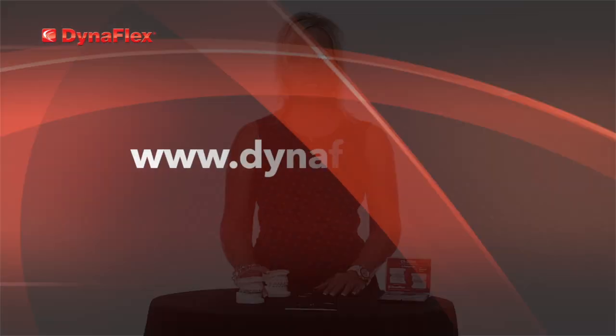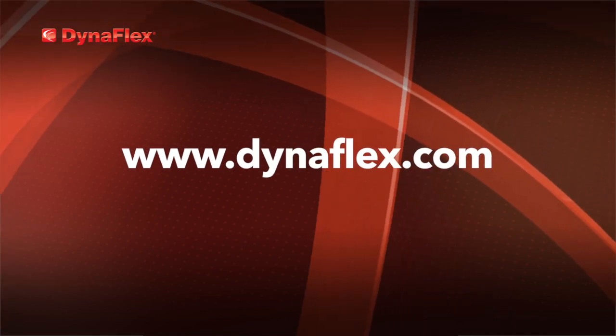As you can see, the system is quite simple to place. Should you have any questions, please do not hesitate to call our office or visit our website at www.dynaflex.com.